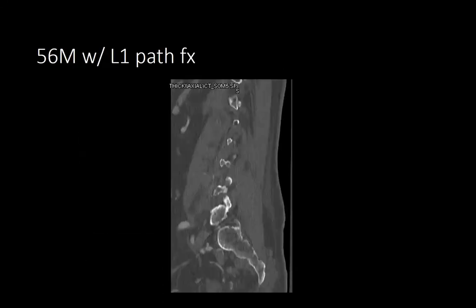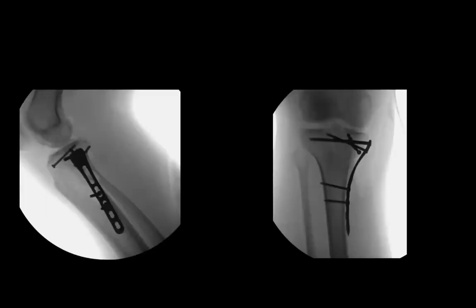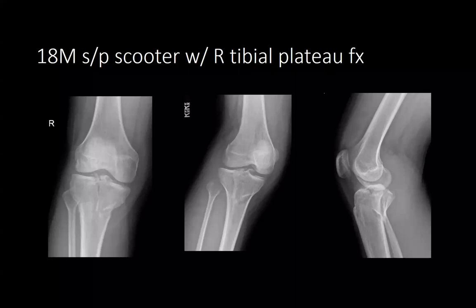What would you call this tibial plateau fracture? Sorry, I had two questions. What's the Schatzker classification? Is this, and what is it? Describe it a little more. It's not just on your CT. It's probably a little more than just the plateau fracture. Yes, this would be a Schatzker 4.